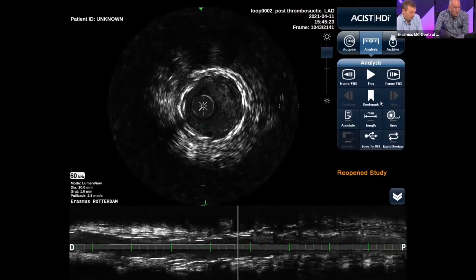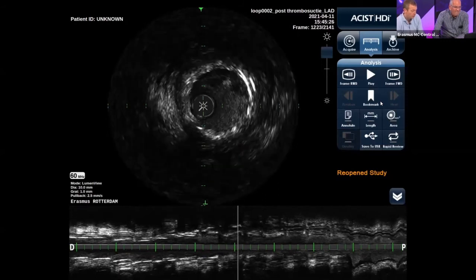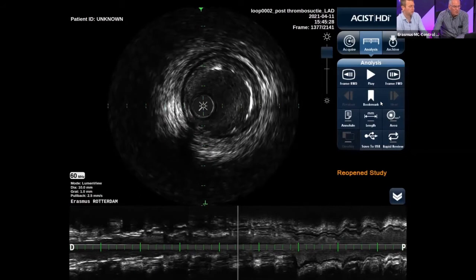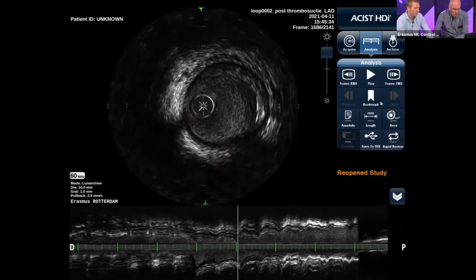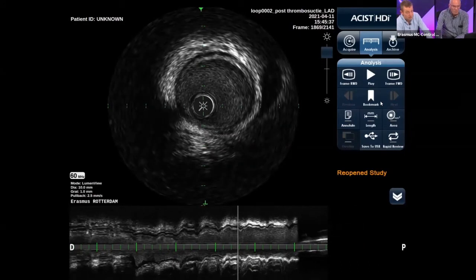Yeah, so. But that is obviously also one of the key reasons we're running this trial, to see if some types of thrombus can be easily or more easily aspirated as compared to other types, which could help us to further fine-tune how we could use thrombectomy or ballooning or any type of plaque or thrombus modification prior to stenting in these cases to optimize post-procedural flow.